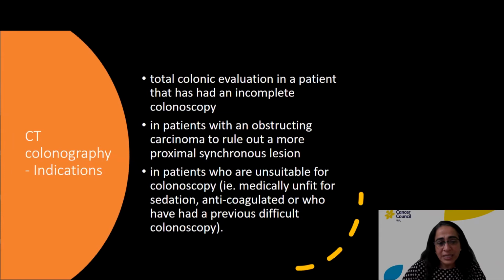Current indications for CT colonography in Australia are for evaluation of patients who could not have a complete colonoscopy. This may be in patients who have obstructive carcinoma and you want to rule out a proximal synchronous lesion, or patients who are too frail or unsuitable to undergo colonoscopy. They may be medically unfit for sedation, or they may be on anticoagulants, or have had a previous difficult colonoscopy. Those are the main Medicare indications in Australia.